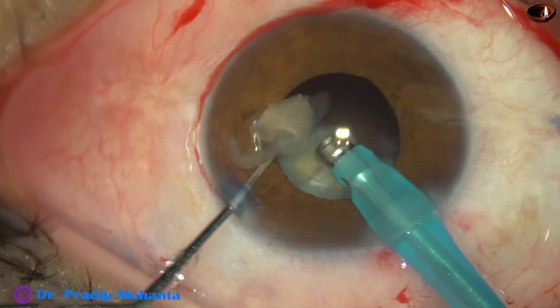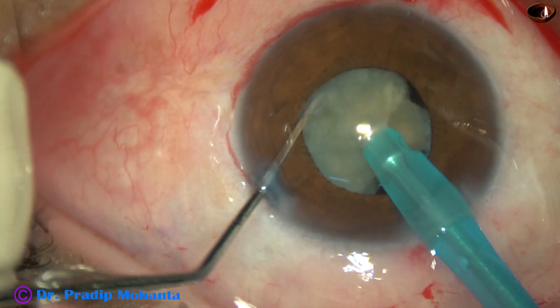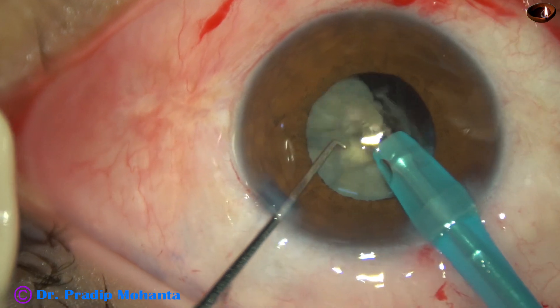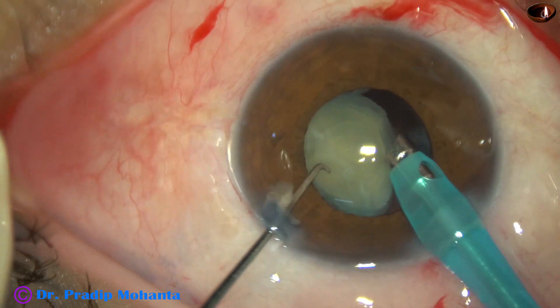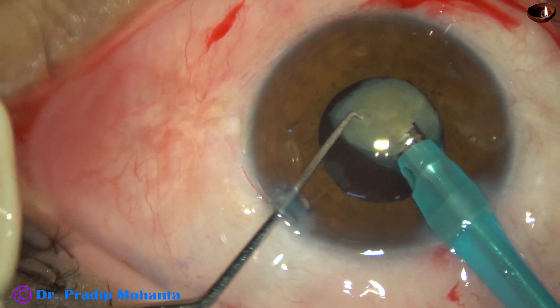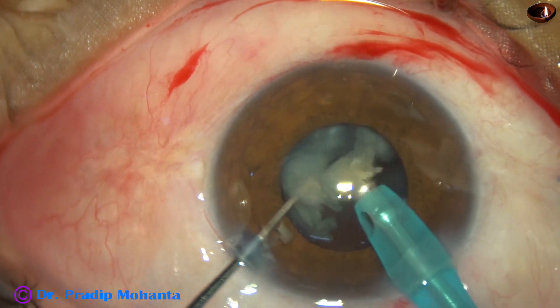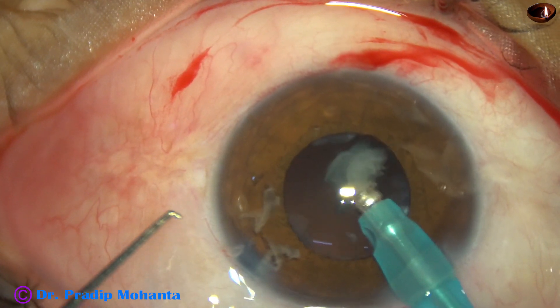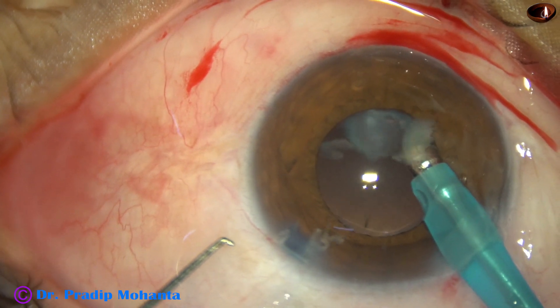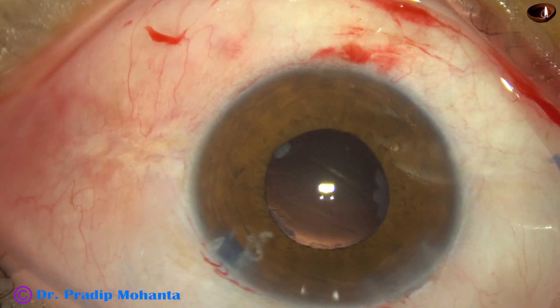And now this is the most tricky part because the posterior capsule is bare. There is no lens matter, no epinucleus, no cortex covering the posterior capsule. And there is a high chance of posterior capsule rent, particularly if the anterior chamber is not stable. I took all precautions not to cause a posterior capsule rent, but I find that there is a very small rent right at the center — just a tiny rent at the center.